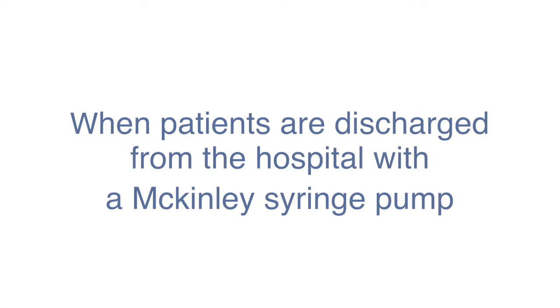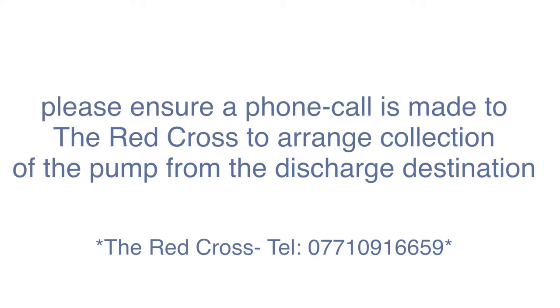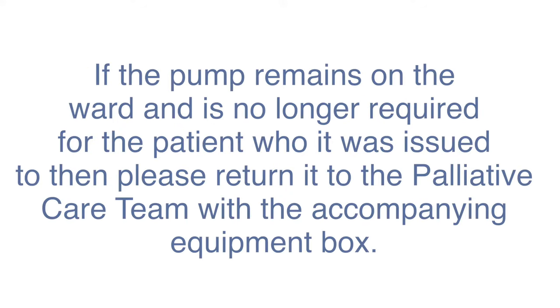When patients are discharged from the hospital with a McKinley syringe pump, please ensure a phone call is made to the Red Cross to arrange collection of the pump from the discharge destination. However, if the pump remains on the ward and is no longer required for the patient who it was issued to, then please return it to the palliative care team with the accompanying equipment box.